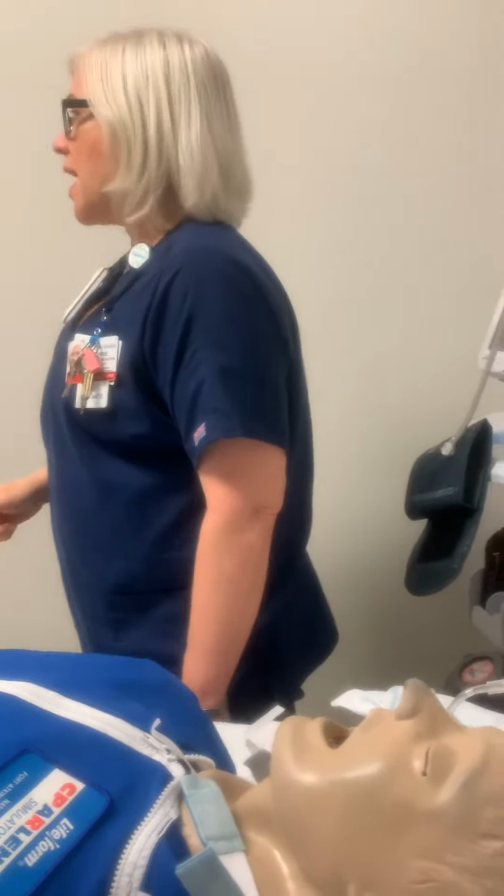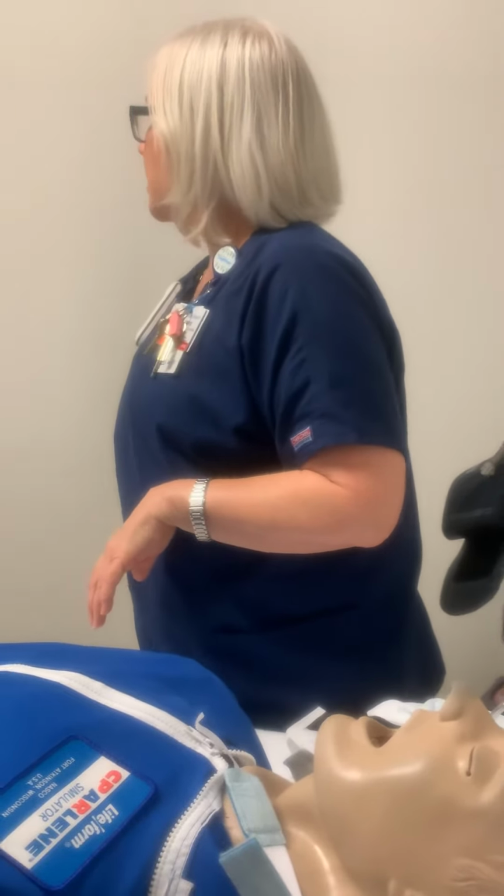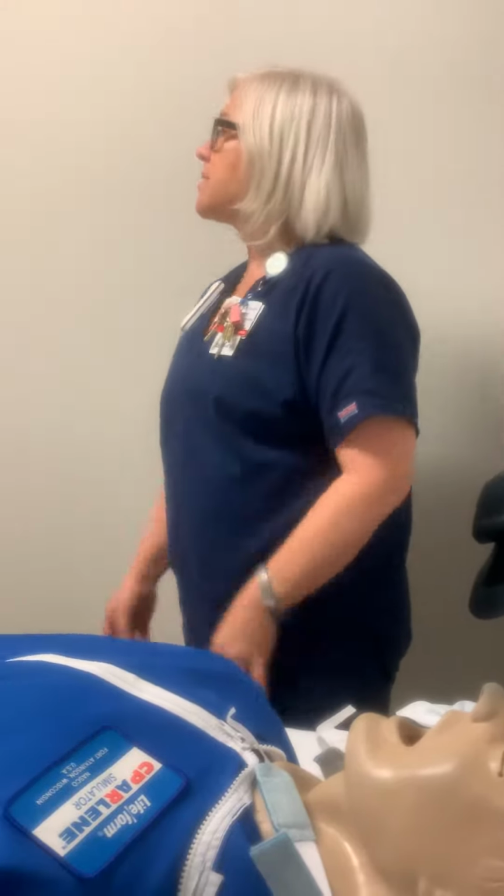But you'd be surprised how many people would do that. And it's been done a lot. So that's why we have this alternate airway initiative at Banner. It's just not here, it's nationwide. If you're walking up on a patient that you don't know, you don't always know which. So it's just best to ventilate the stoma if you have no clue, but here in the hospital, you should know.